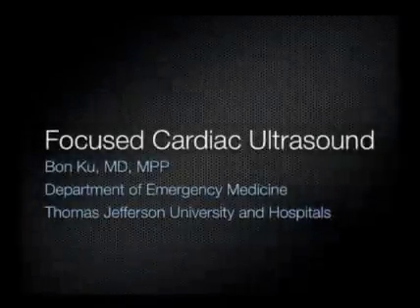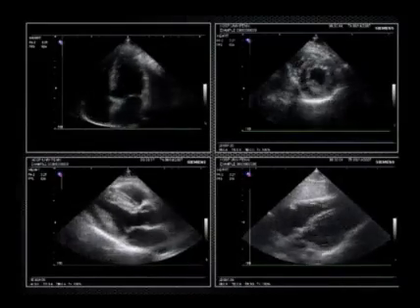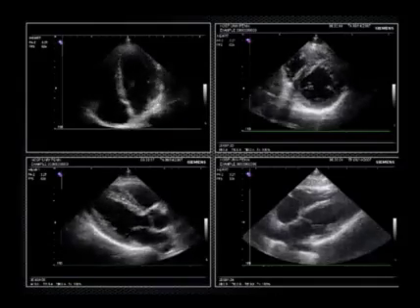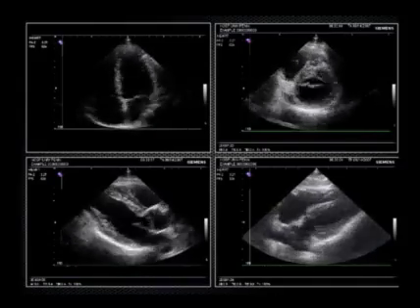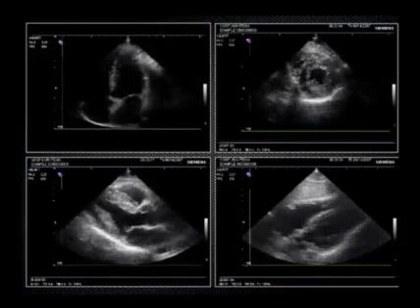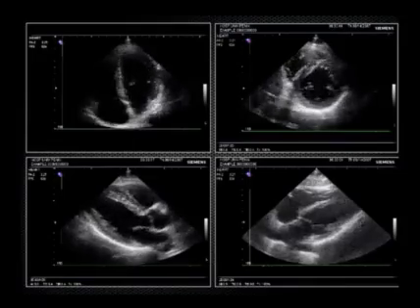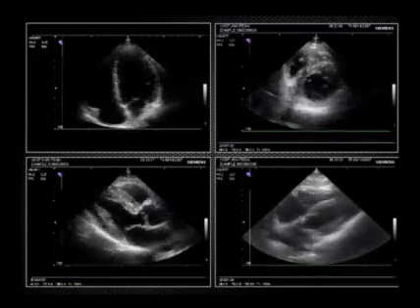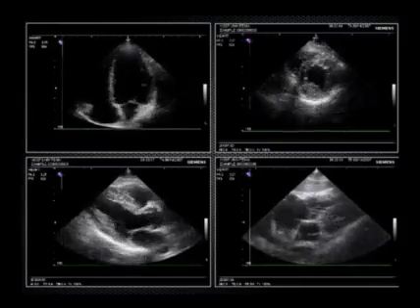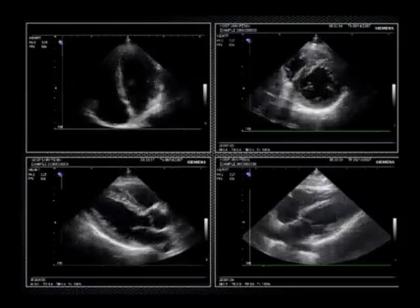This lecture will provide an overview on how to perform a focused cardiac ultrasound. I will not be describing how to do a complete echocardiogram as performed by cardiologists, and I want to stress that a focused cardiac exam should not be a substitute for a complete one. The focused cardiac ultrasound is a two-dimensional transthoracic examination that involves imaging the heart in the four views represented here. At the end of this lecture, you'll be able to identify these views and learn the technique in order to perform them.